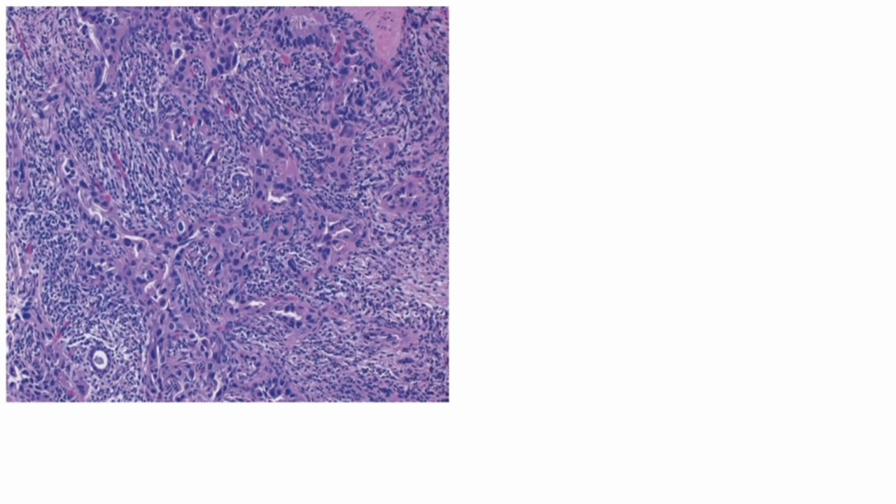This is again a third pattern of serous carcinoma. Here you can see the solid infiltrative pattern of the tumor cells. There is no glandular pattern, no papillary formation, but solid areas of tumor cells are present, and in between there is inflammatory infiltrate in the stroma.